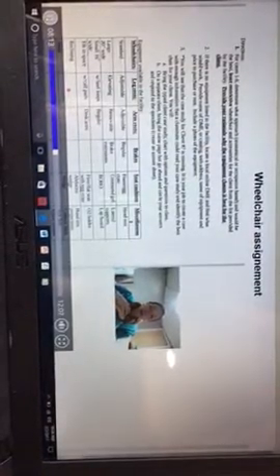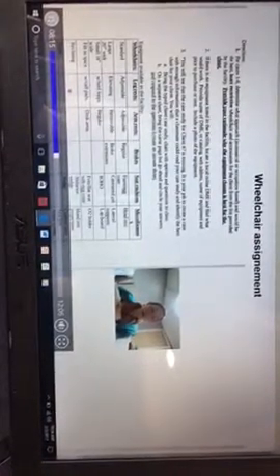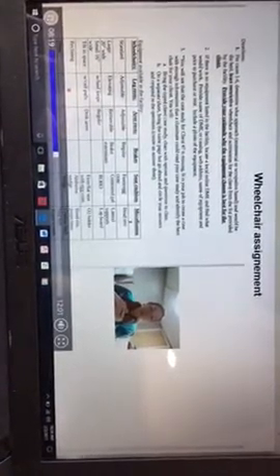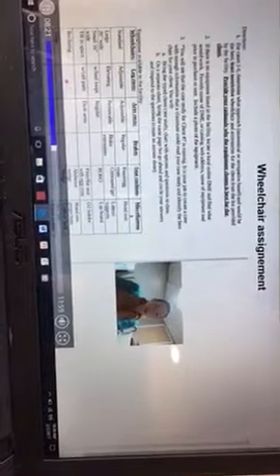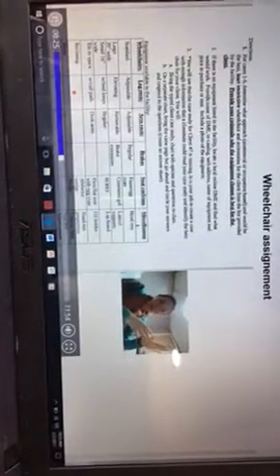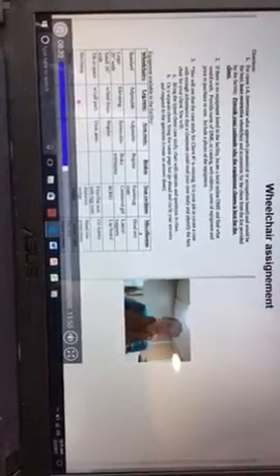Somebody with really poor trunk balance, that could be an issue sometimes, because as you go to do a slide board transfer out of there, you scoot to one side, and if you press down on one side, the air all flips to the other side, and so it can flop out of your chair as the air is moving.